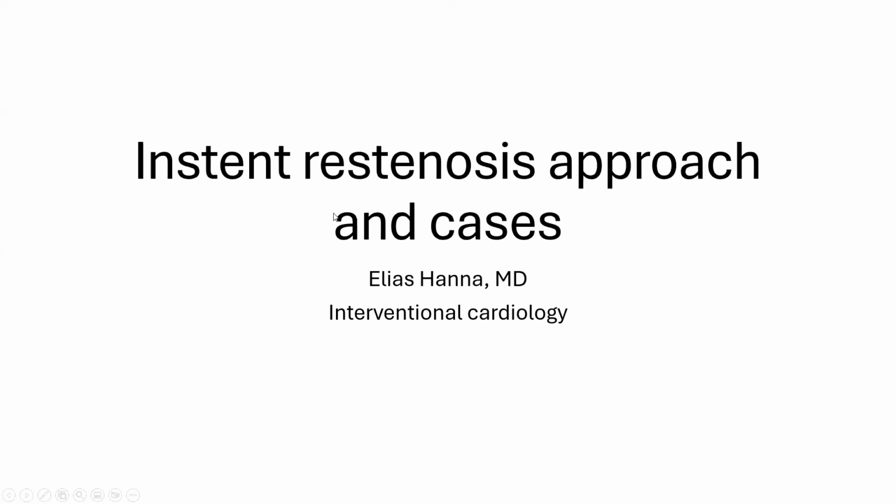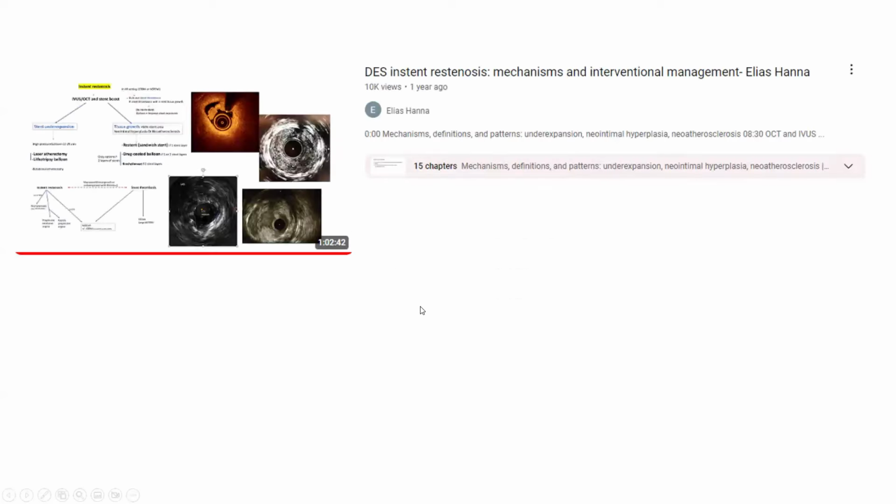I want to talk today about in-stent restenosis. I strongly suggest that you review my prior talk on in-stent restenosis, where I detail the various mechanisms, therapies, and algorithm with data and numbers. I will summarize those today and show some practical complex cases.